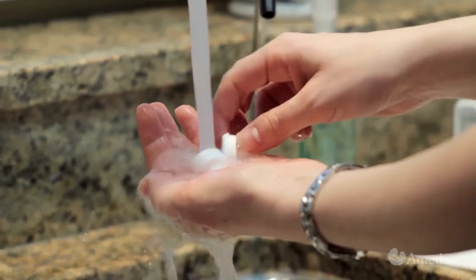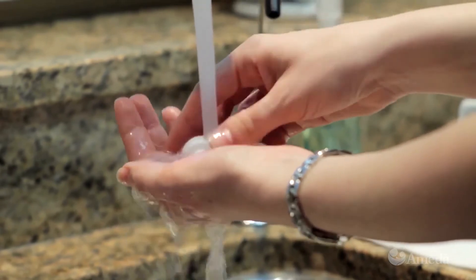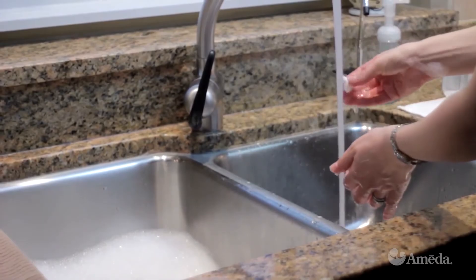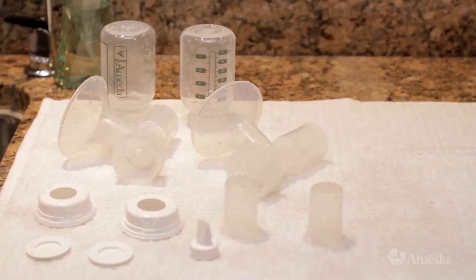Be especially careful with the valve. The valve should always be washed and rinsed gently and should never be scrubbed with brushes or anything abrasive. To ensure the best performance of your breast pump, we recommend replacing valves every 8 to 12 weeks depending on cleaning and use.